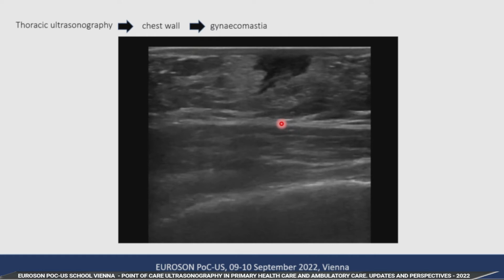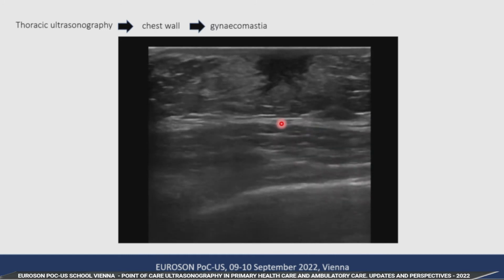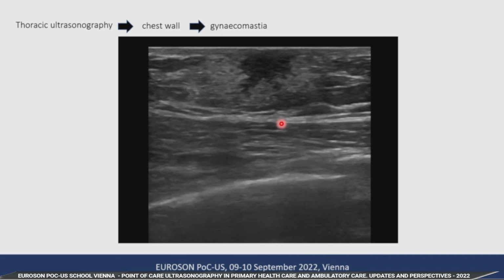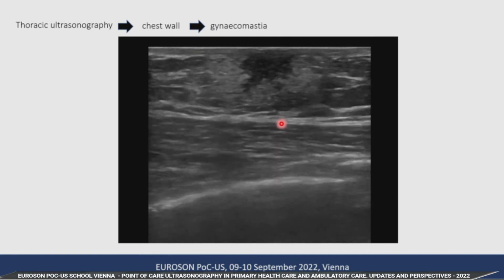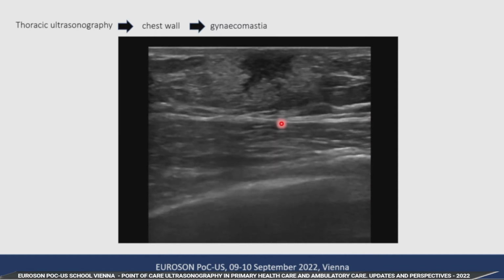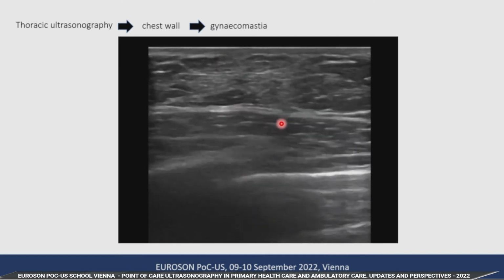Why? Because he might have a tumor that is producing hormones which are changing his breast images. And the initial diagnosis, the real problem might be in the testes. It sounds crazy that we have a topic about thoracic sonography, and I am trying to encourage you to examine testes. Yeah? But this is how it works. This is how modern sonography in a primary physician examination room works. This is what you came here to hear.